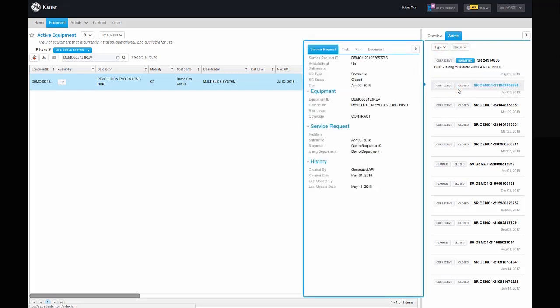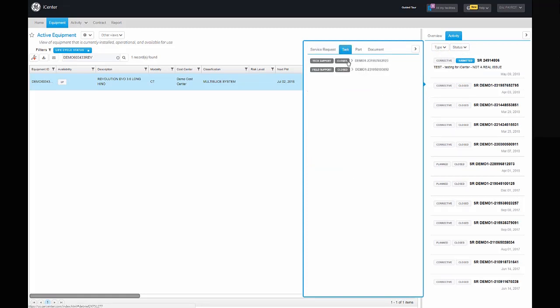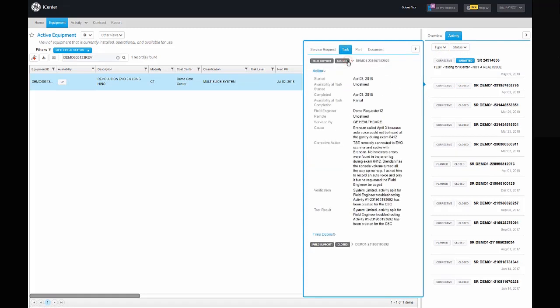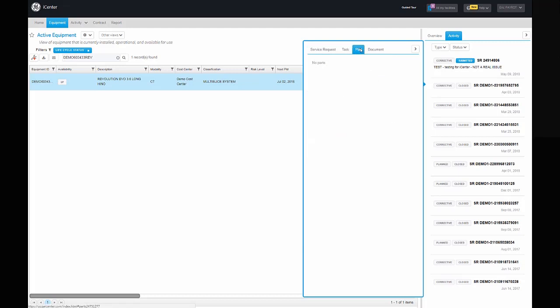You can view specific service request details, technical debriefs by GE field service engineers, parts changed, as well as attached documents.